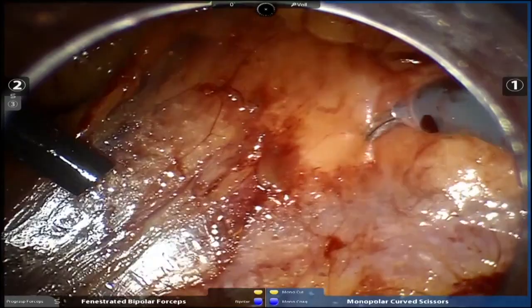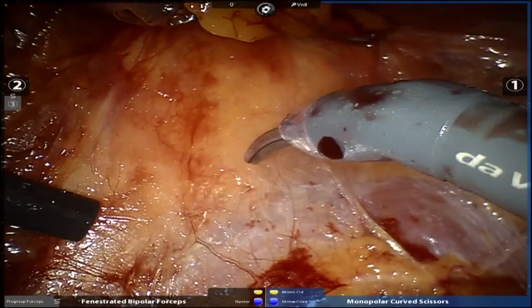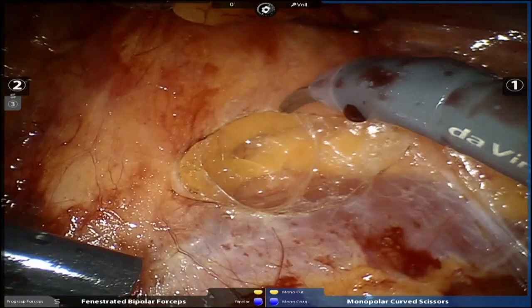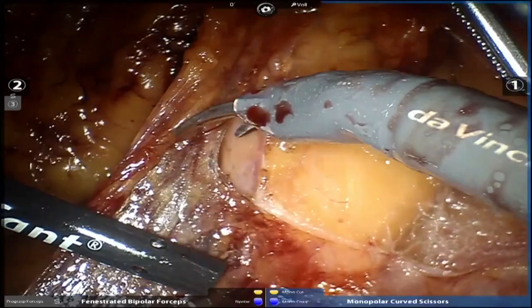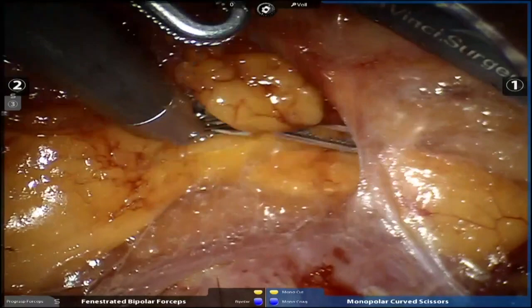So what I'm going to do now is enter Gerota's fascia, and this is the space where the kidney lives. So I'm going to make an incision in Gerota's just like that. This top edge here is very important. That's going to be very important later on in the case when I look for the kidney. But I'm going to make this incision parallel to the psoas muscle. This is some perinephric fat. And I'm going to continue this incision in Gerota's fascia.